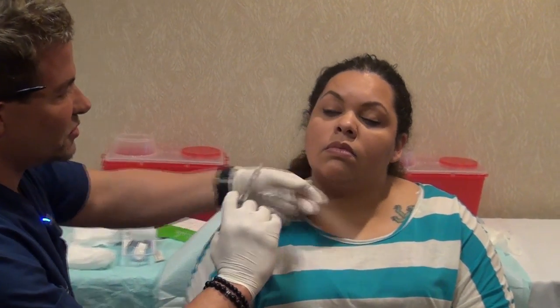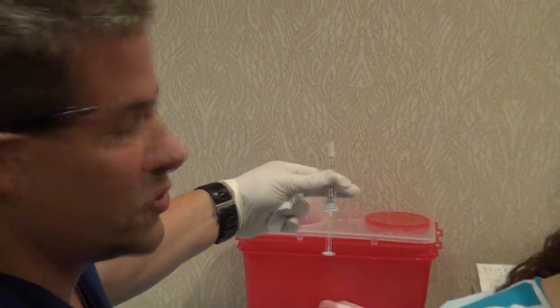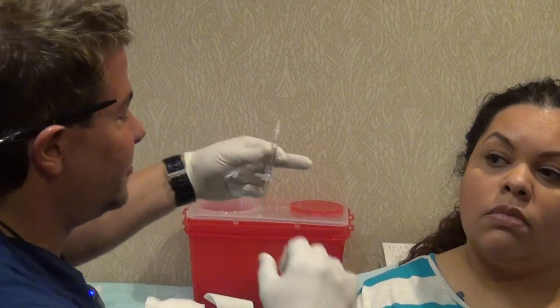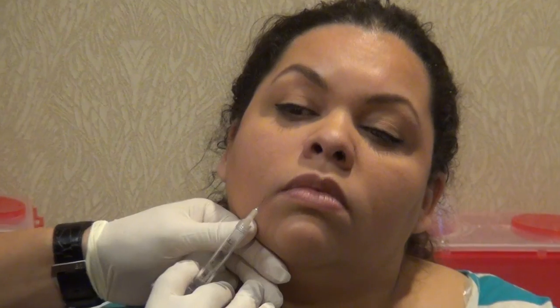Try to approach from the side — don't approach the patient with the needle in plain sight. Work from the side, talk to them, and keep the syringe and needle off to the side. Let them know what you're doing: 'I'm just going to inject a little bit right over here.' There's lidocaine in this product too, so once it kicks in I'll go to the other side. Going back and forth gives the lidocaine time to work and helps the patient feel more comfortable.